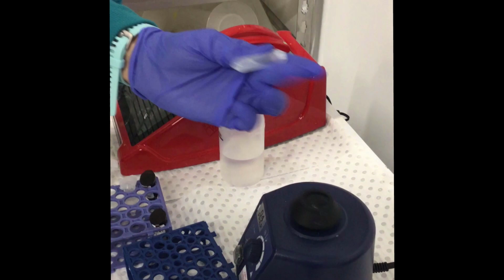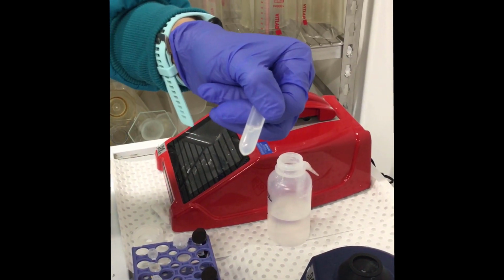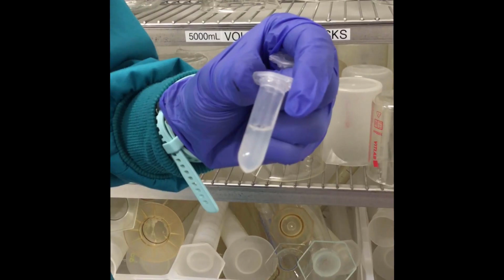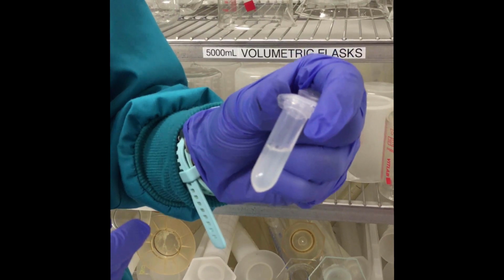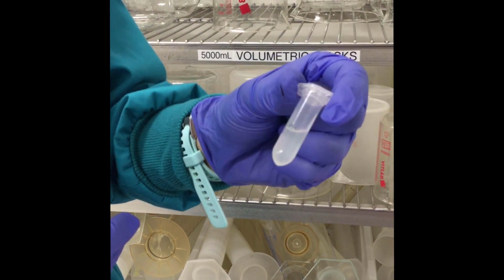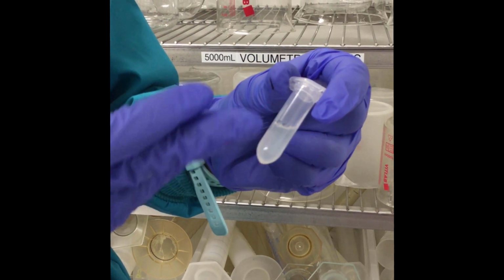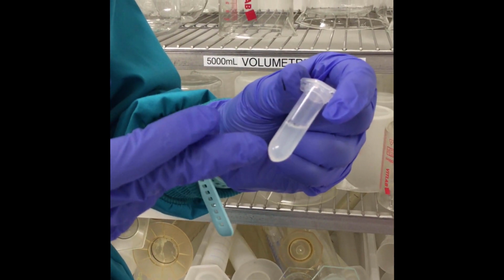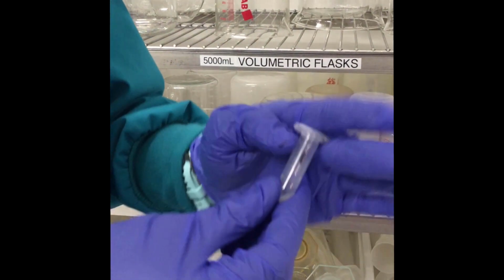You'll end up with a cloudy solution. That's your proteins precipitating out. Our solution's now been sitting for several minutes. You would then centrifuge the sample, and that allows all of the floating precipitant to move to the bottom of the vial. Here's one we prepared earlier.